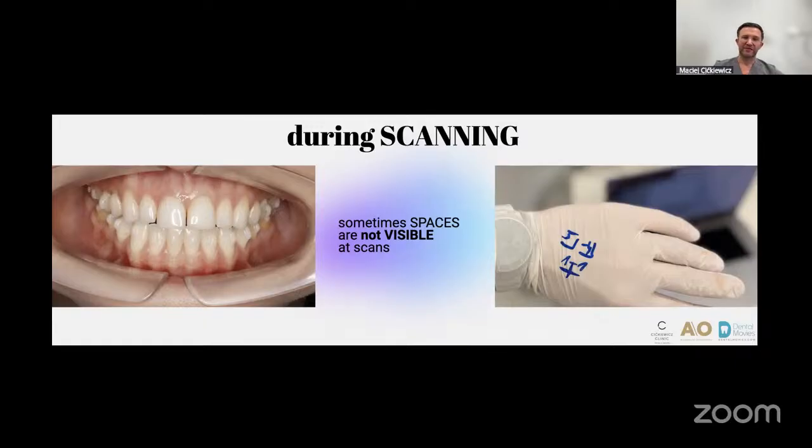So when we have a very fast visit and we want to be very fast with that, it's good to write down where exactly we have the spaces between the teeth, because sometimes they are very clear to indicate and we can see them, but sometimes it's not clear. It's not because we don't have a photo from the right side, it's because sometimes it's very difficult to assess. So it's better sometimes to indicate how many millimeters we have between them.